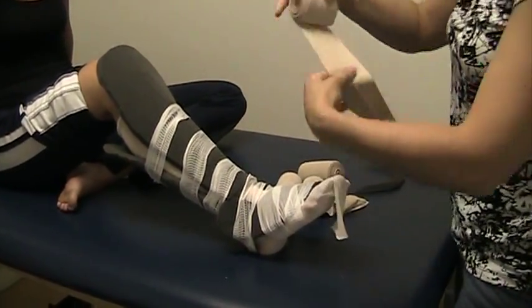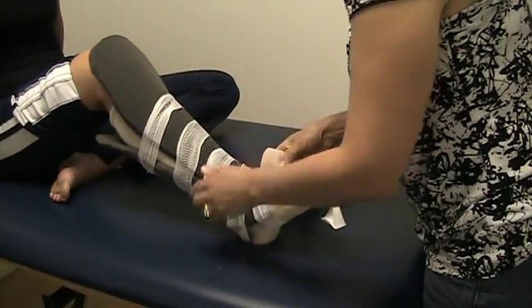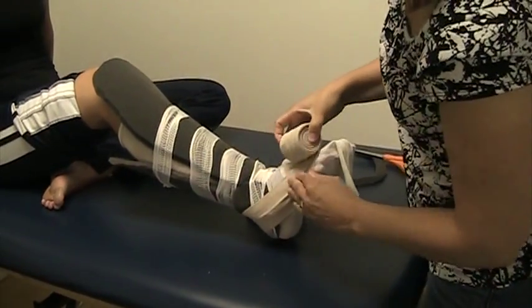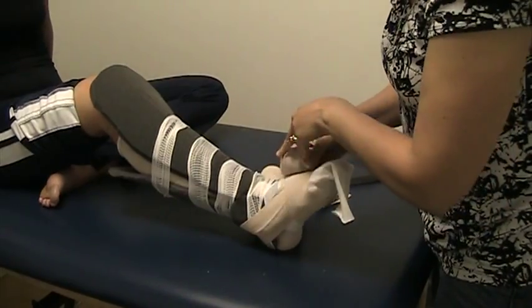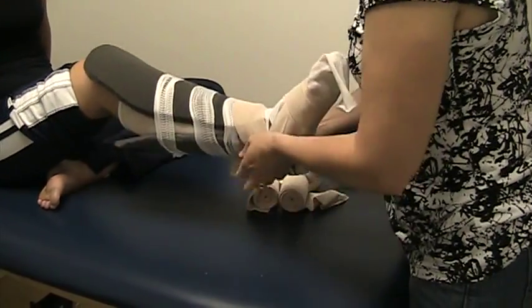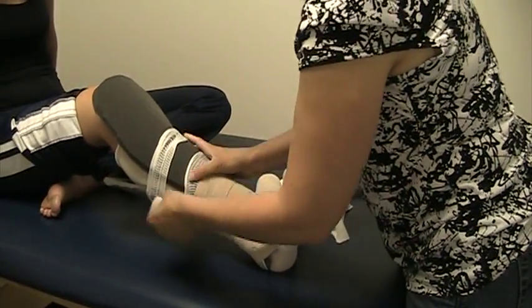The first short stretch bandage we'll be using is a six-centimeter bandage. Wrapping it first around the toes — there's no stretch on the bandage when you're applying it. Going another wrap around the toes, coming back to the heel, and then it is applied in a half overlap of the leg. No additional stretch applied.